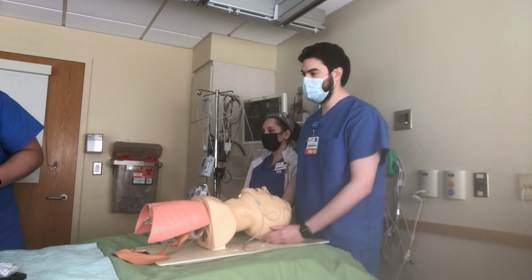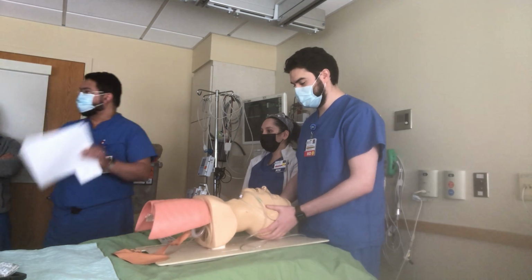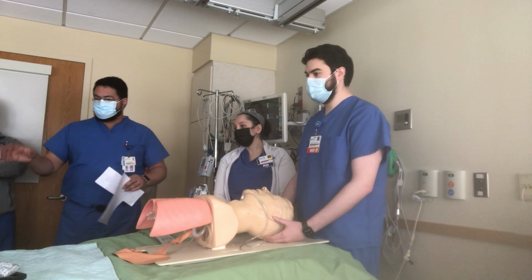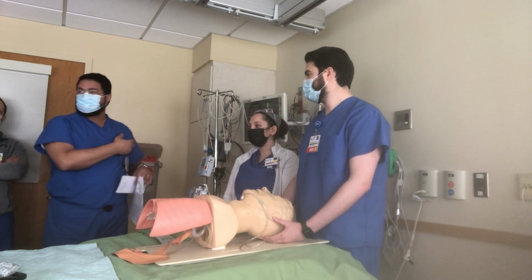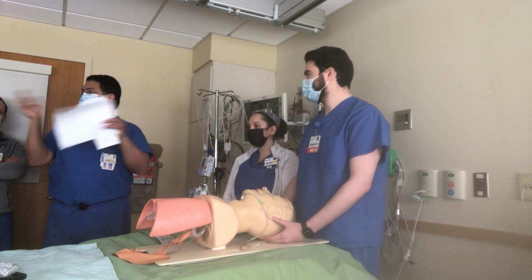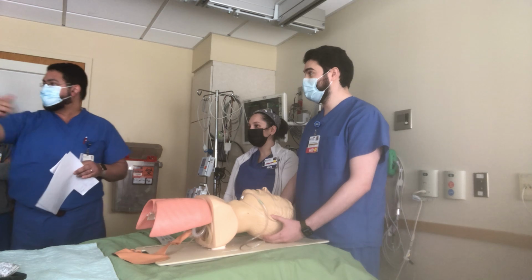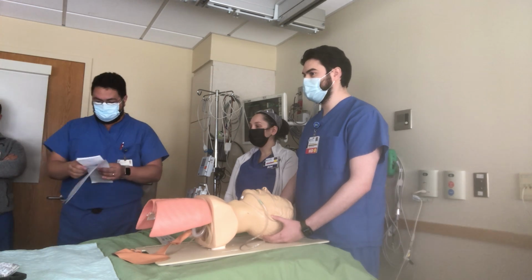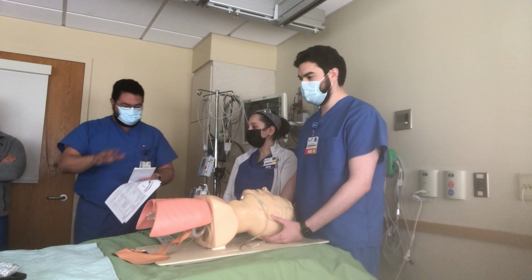But also you have here a suction catheter and a nasal cannula. By the way, in the last mock airway we did, we didn't find a nasal cannula in the room. People were just running all over the place. This has a nasal cannula and this has a nasal cannula. If you bring the card, the whole card has a nasal cannula in it, so you can quickly jump into things. So we move the things.